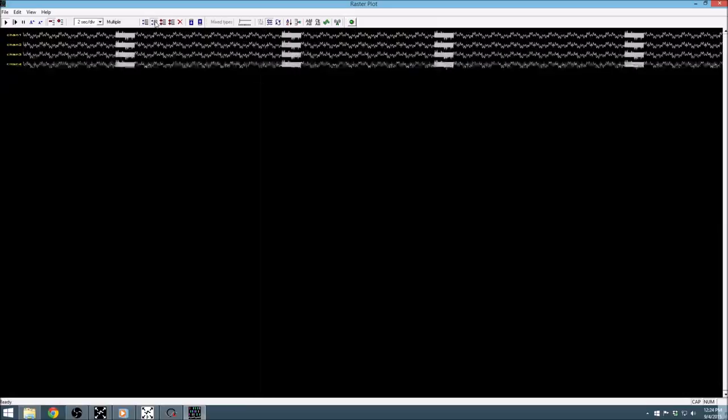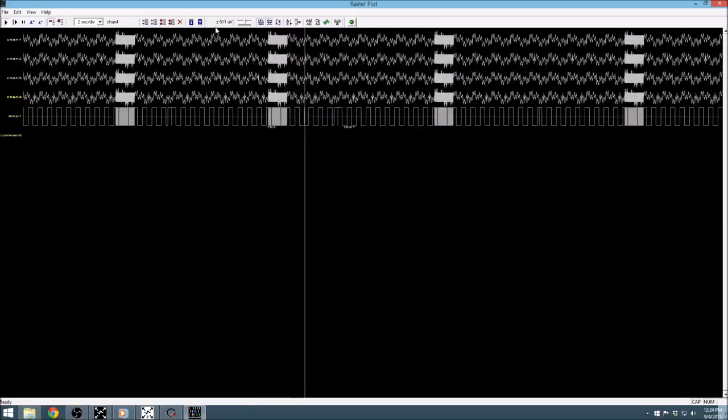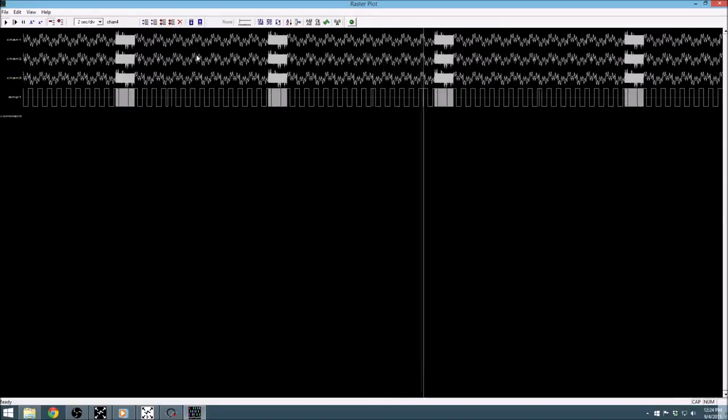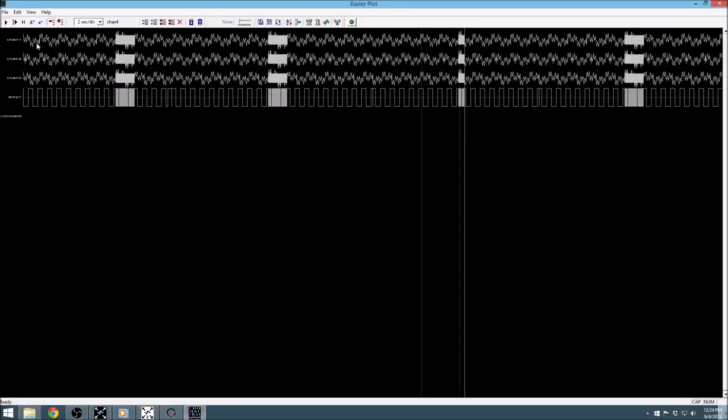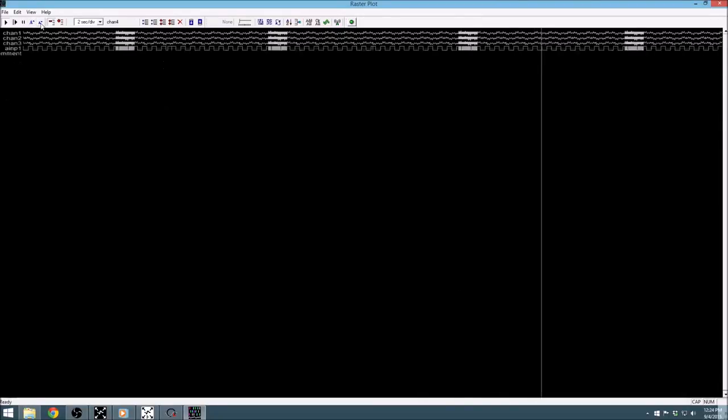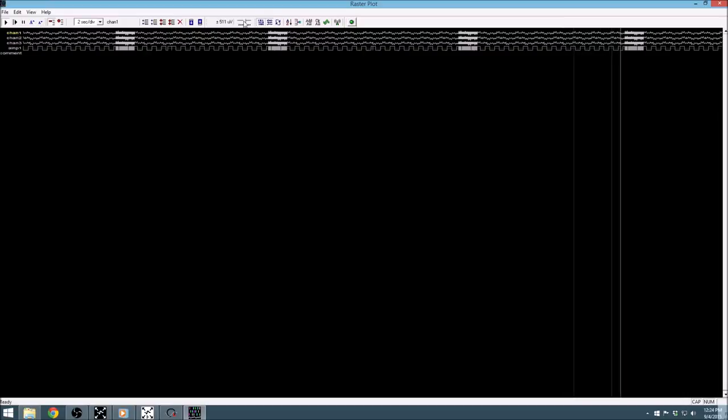The blue upwards and downwards arrows will change the position of the channel within the list, while the red X will remove the channel from the list entirely. In addition to channel position and size, we can use the text tools to change the size of the display text. If continuous data is available, we can utilize the slider in the upper toolbar to change its vertical scale.